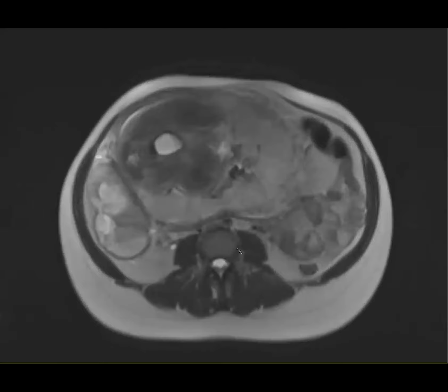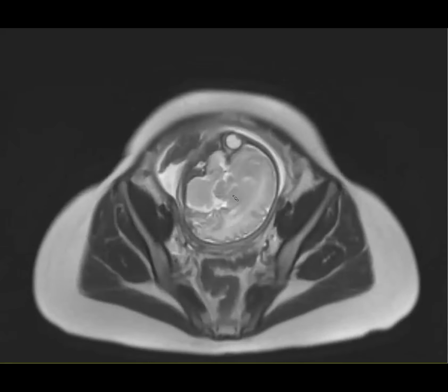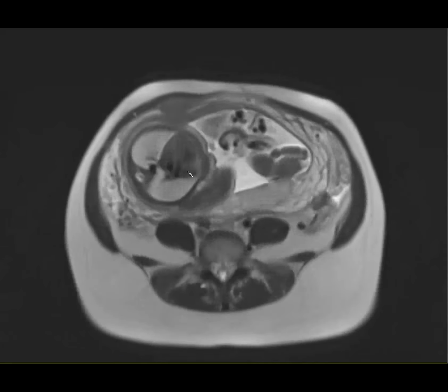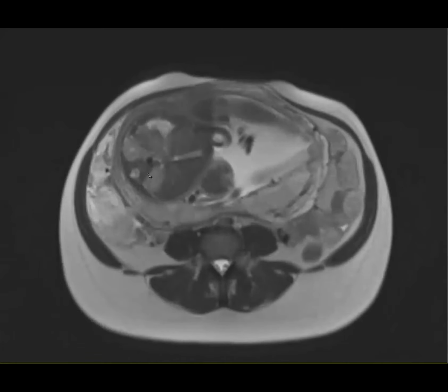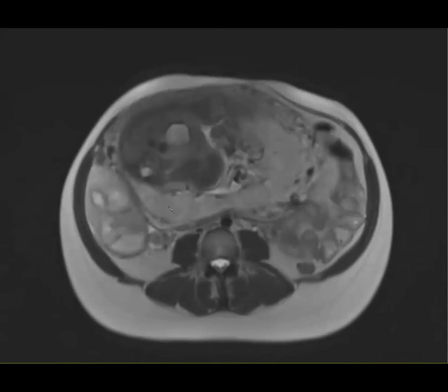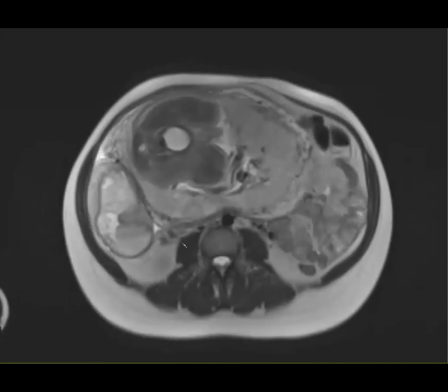So, okay, this is the next case. You can see that this is a pregnant patient. And we can see there's no ventriculomegaly, nice fluid-filled lungs, heart grossly normal. Looks like the stomach is within the abdominal cavity. We don't see any hydronephrosis of the kidneys. And then this is the bladder. So this patient had pain. So anyone have any thoughts here?